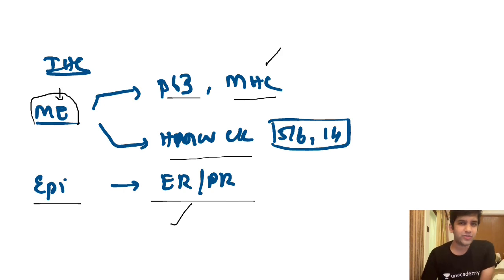Personally, I use myosin heavy chain and ER/PR for almost every case. If I want to report a DCIS, I still apply them, and I'll be more comfortable. Say I will write it's DCIS, but I'll do an IHC, I'll confirm, and I'll give it to the surgeon, he or she, whatever it is, so I'm giving proof that whatever I diagnose is correct.